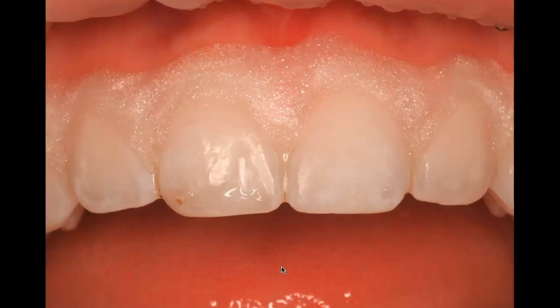Do I want to do maybe a little bit more etching, like in this area here where I can still see these white spots, or not? And so what we typically do is we go back and forth: etch, alcohol preview, etch, alcohol preview, etch, alcohol preview, until you get to the point where, one, either everything looks good when you do your alcohol preview, there's no white spots you can see, or two, you're not really seeing any improvement. You did a whole round of etching, and this looks exactly the same, meaning that you're probably not going to be able to go deep enough to access it, so you're going to just leave it.